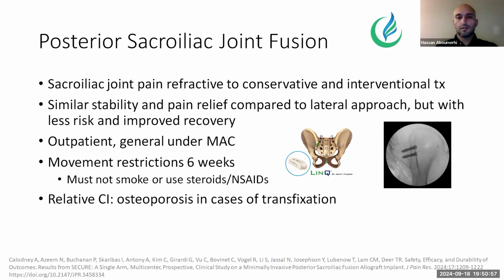Meanwhile, the distraction itself, the approximation itself, with these implants produce really rapid results in these patients. And most all of them are supposed to encourage fusion as well, although each device has its own technique to try and encourage that. Some, like the image on the left, use a purely cadaveric implant without any sort of metal, whereas the one on the right uses a titanium alloy. The goal again is to form a fusion there and help stabilize the joint better.